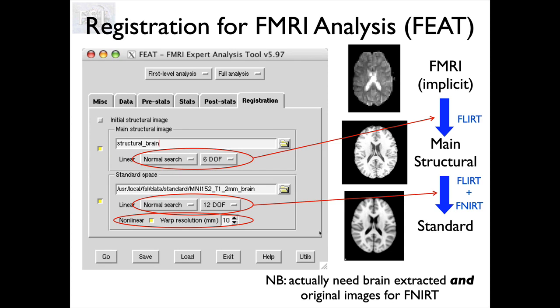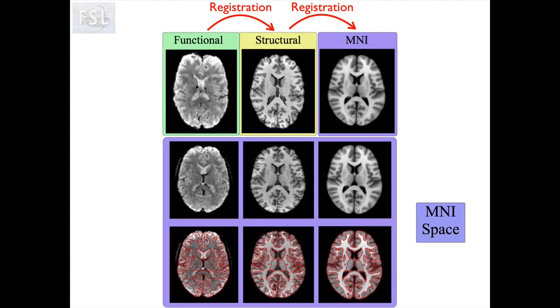To illustrate visually: the top row shows the three original images — functional, structural, and MNI. The second row shows what happens when all transformations are applied to get them into standard space. The bottom row shows the same grayscale images from the middle row, now overlaid with red edges extracted from the standard-space image. The red edges should align nicely with tissue boundaries, which is easy to see in the structural and in many areas of the functional. This red-edges-on-grayscale display is really useful for evaluating registration performance.